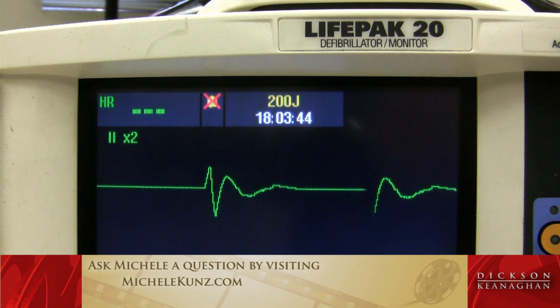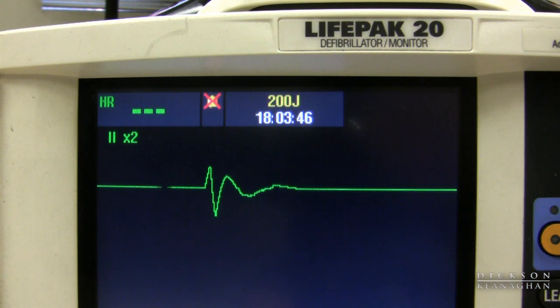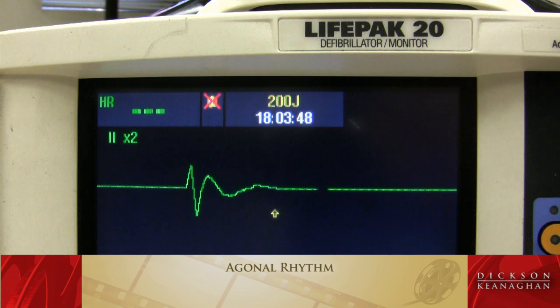This is not a good picture. This is an end-of-life picture. They call this an agonal rhythm.